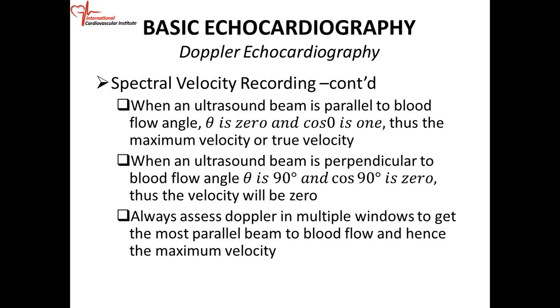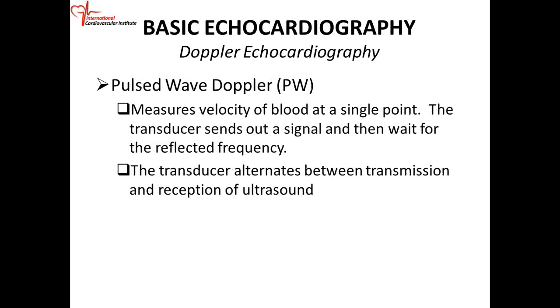Okay? And that is why we do echo from multiple sites. We want to get the ultrasound beam as parallel to the blood flow as possible. All right, so that's Doppler in a nutshell.